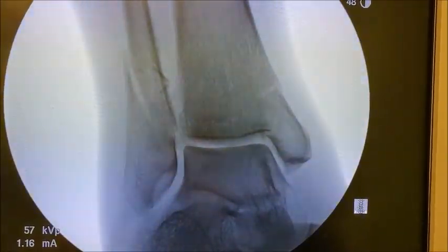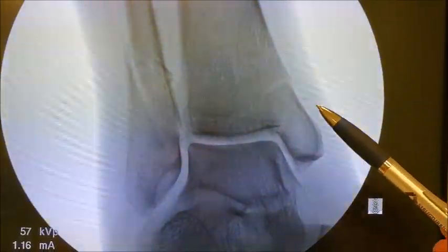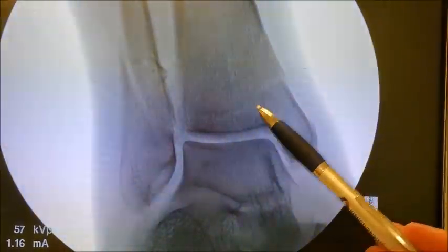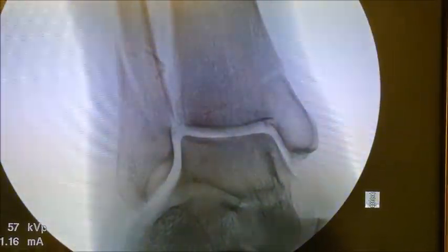Here we can see the patient's fibular fracture, which is the long bone here. You can see that angled break there. And you can see the medial malleolar fracture here. There's a third additional fracture in the back of the ankle, which we'll show in the next image. That fracture, however, is less than 25% affecting the joint. Based on the literature and experience, we don't fixate this fracture because there can be more damage caused by the dissection than the actual repair.